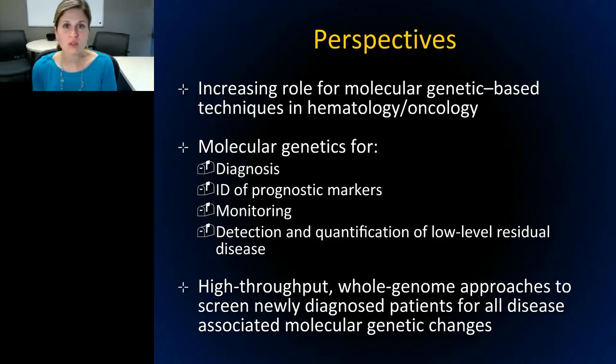Real-time PCR is very useful as well if you have a known point mutation. Is one better than the other? In some cases, yes. FISH is going to be useful if you have a fairly large number of cells. Real-time PCR is more sensitive. You need fewer cells, and you are going to be looking at the single nucleotide level, whereas with FISH you're going to be looking at a larger transcript. But what happens with real-time PCR with these fusion transcripts is you're bridging where that fusion has actually taken place, so that you can see the actual transcript or maybe loss of it at another place within the genome.